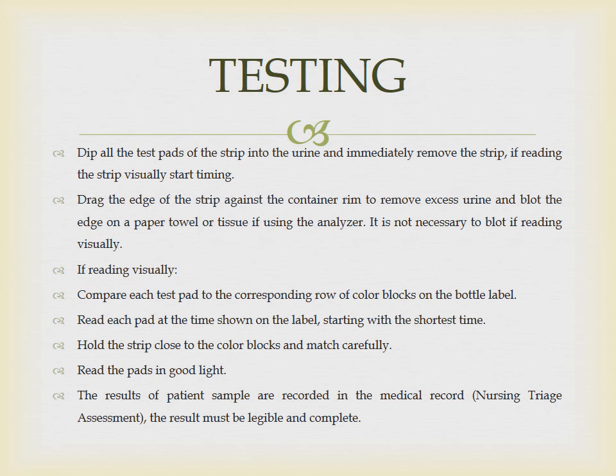The results of the patient sample are recorded in the medical record, nursing triage assessment. The result must be legible and complete.